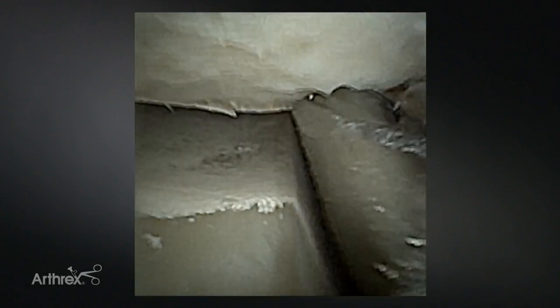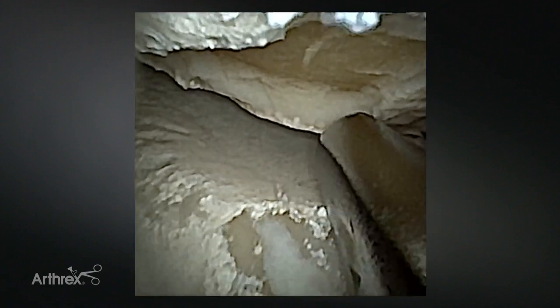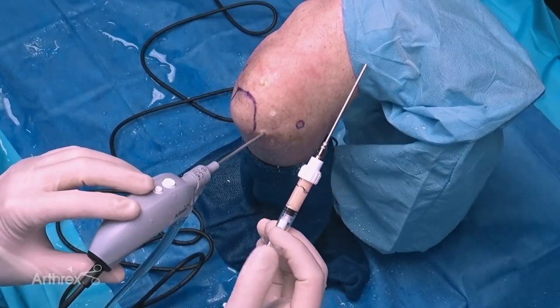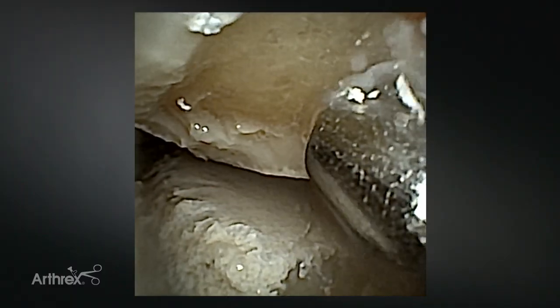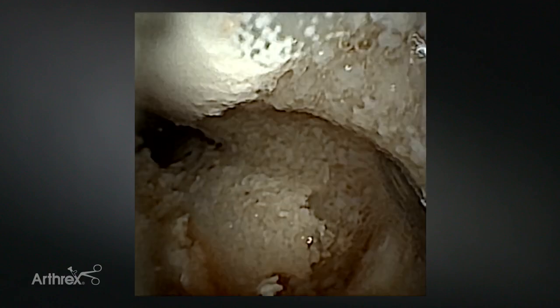Moving here gives me an even better look at this defect, and I still have plenty of room to get an instrument in. Now I can see the far leading edge of the defect as well, and I have a nice stable shoulder around the periphery of the lesion. Now that our surface is prepared, we'll inject the biocartilage. We've prepared our biocartilage and have this small nano inflow-outflow cannula hooked up to the syringe, which will allow precise delivery. I'll come in through the accessory soft spot portal, inject our biocartilage into the defect, and then use our paddle to contour it and push it into place.